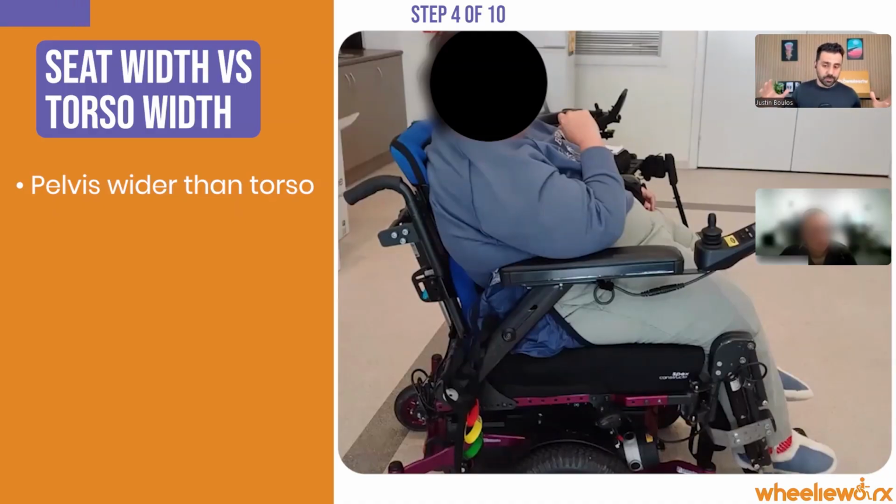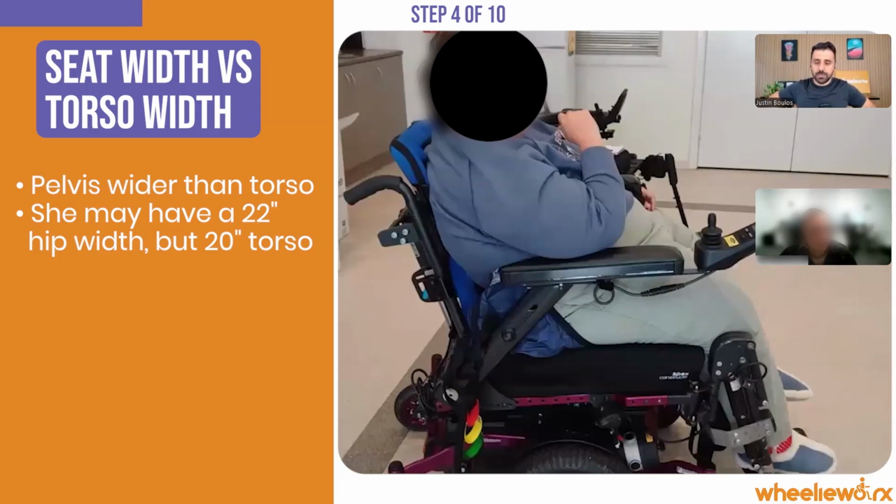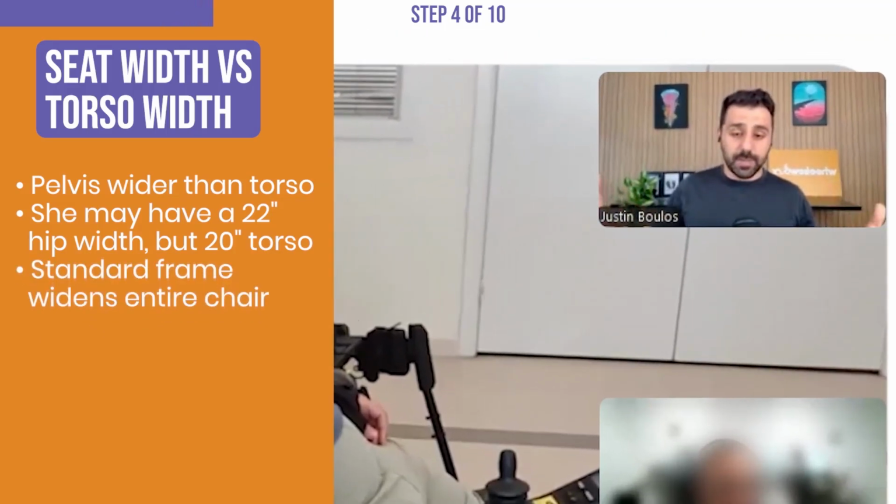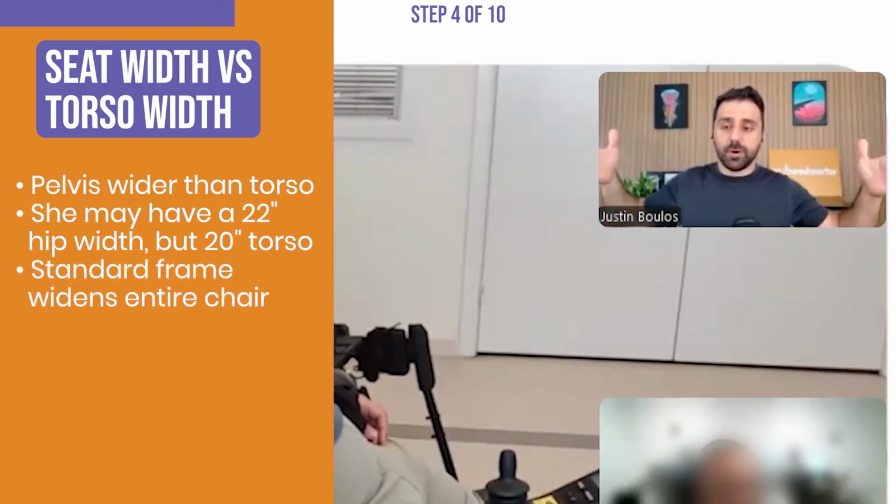I'm not too sure about how to do it on the Glide Centro, but she might be 20 inches at the torso, but she's 22-inch wide at the base. But unfortunately with the Glide Centro, if you go 22 inches wide at the base, that means the armrest and everything else will be widened out with it. And that's going to make the chair really wide. It's also going to abduct her shoulders more than what's necessary.